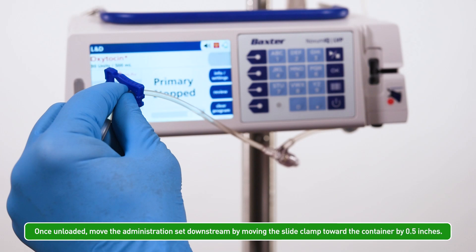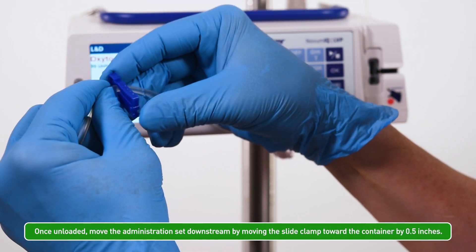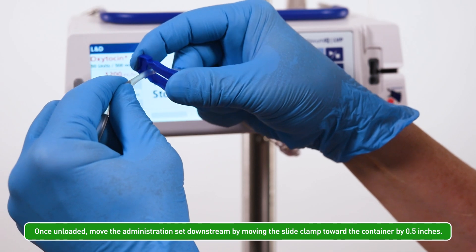Once unloaded, move the administration set downstream by moving the slide clamp toward the container by 0.5 inches.